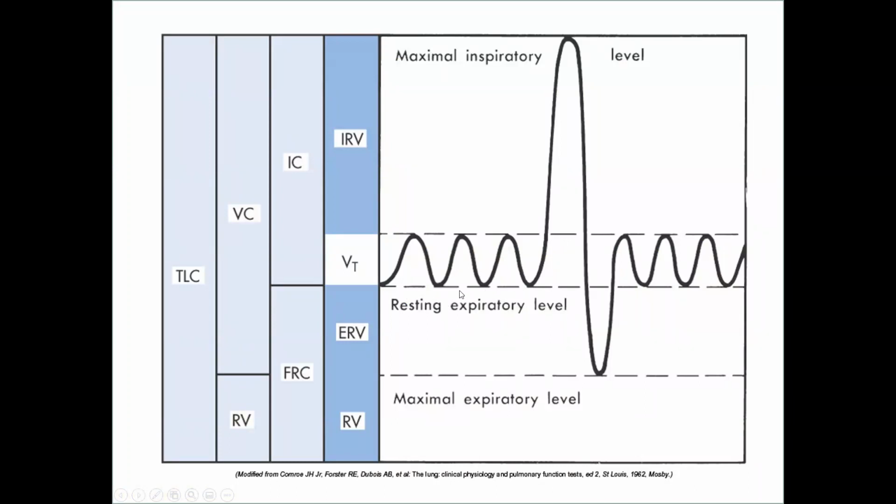The significance of this slide is not just to show you on the left-hand side the relationship between these capacities and volumes, but to give you an idea when you're coaching a patient, whether in a PFT lab or at the bedside. You instruct them, put the nose clips on, a good tight lip seal, and you want them to take some breaths normally, normal in, normal out, and then a deep in, and then out, out, out, out.